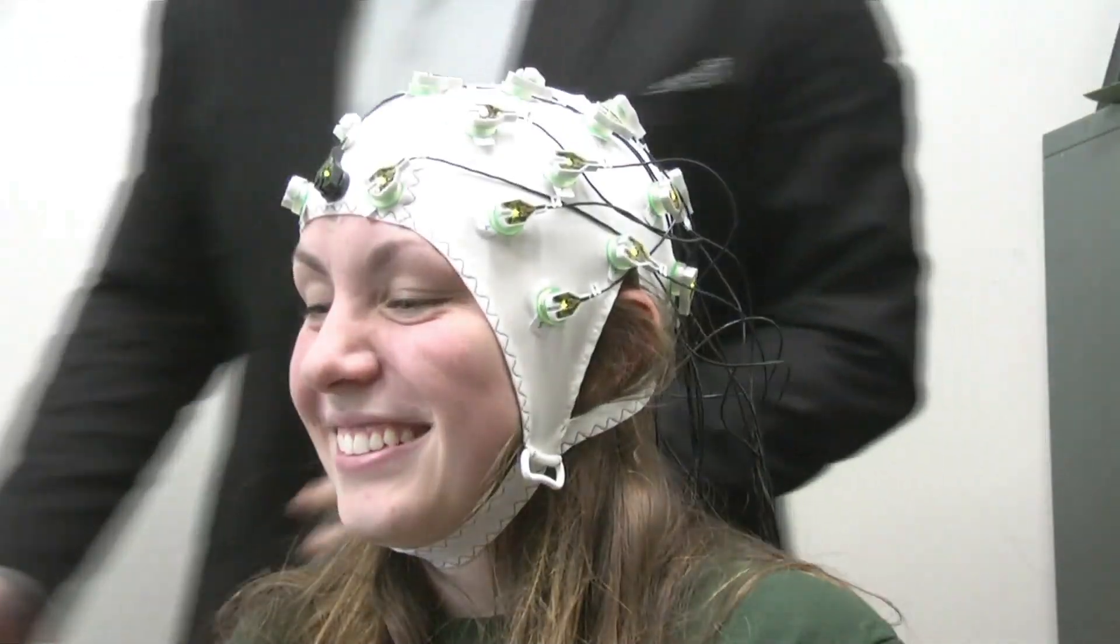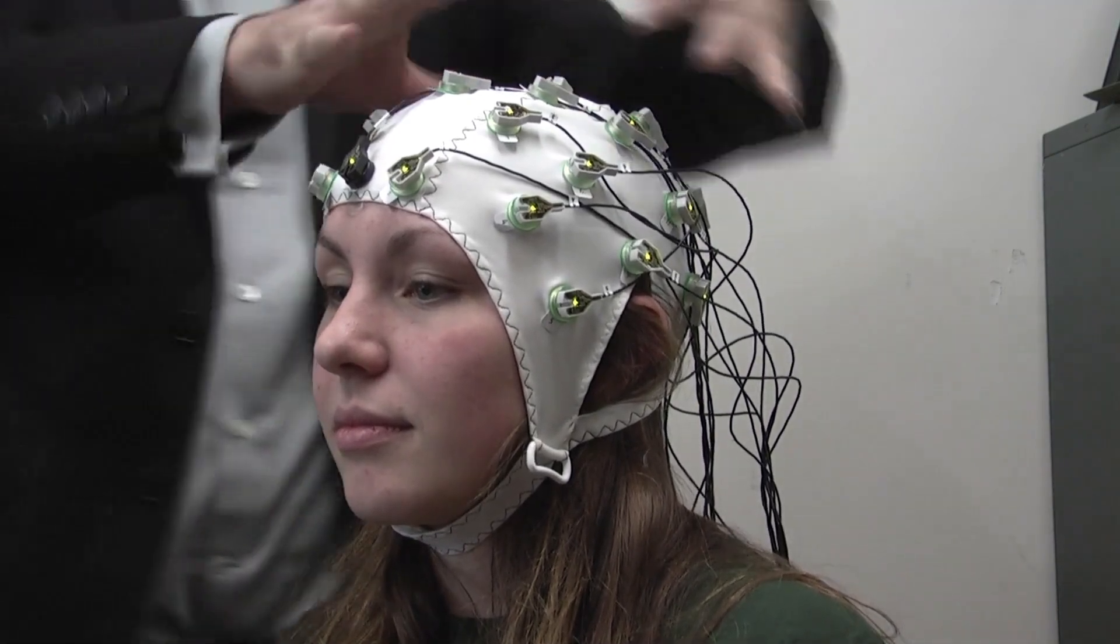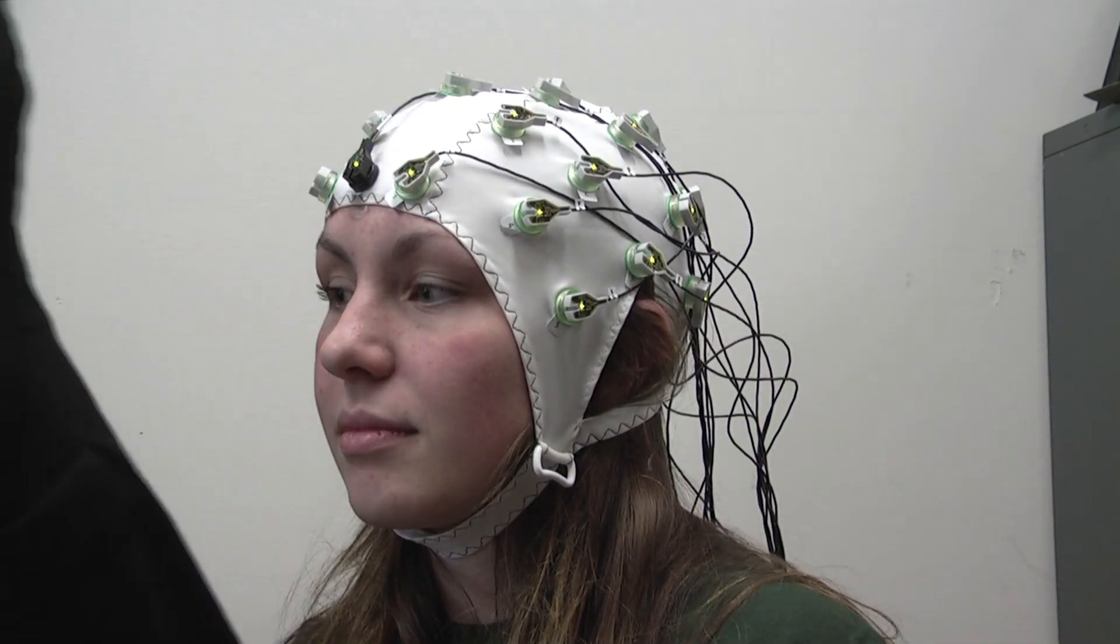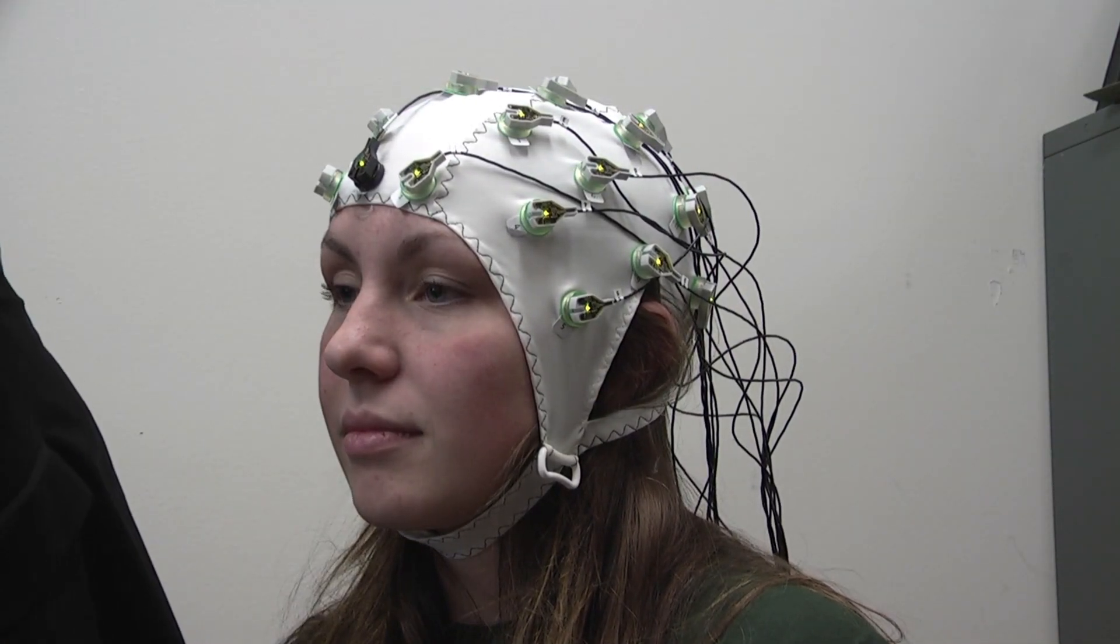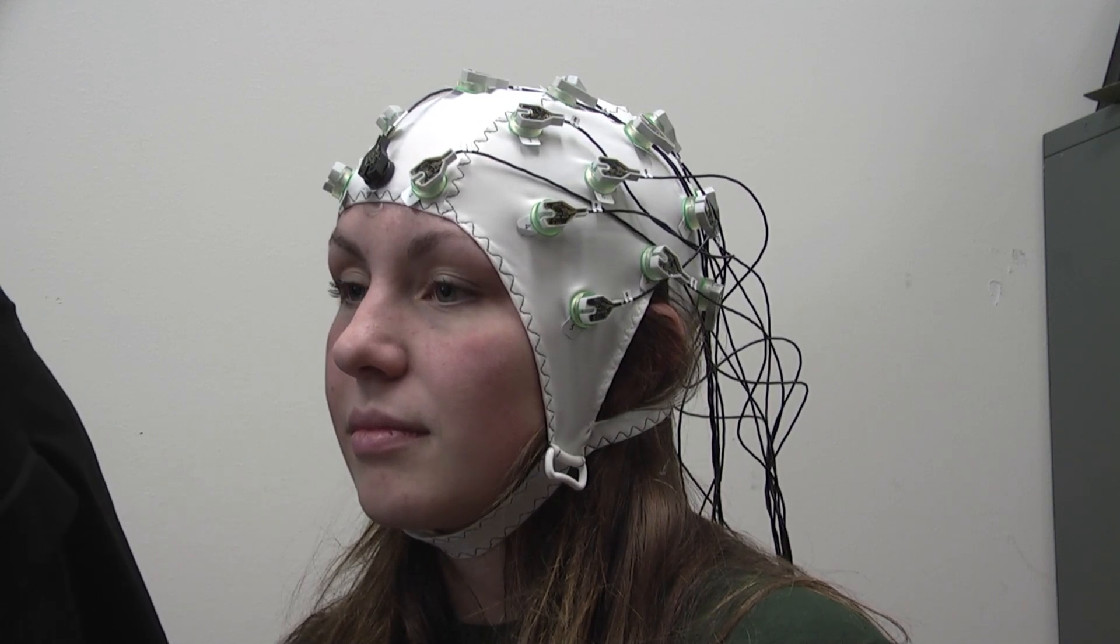So this is called impedance mode. And what we're doing is setting up the EEG itself. We're trying to get a feel for how good of a signal we're getting. And once we know we have a good signal, we are good to go.